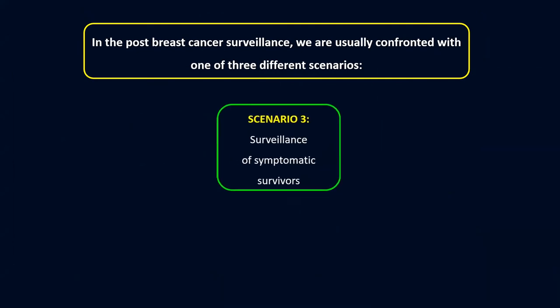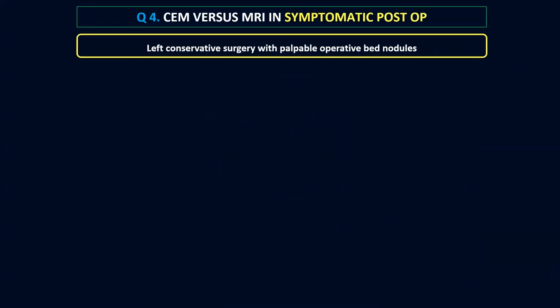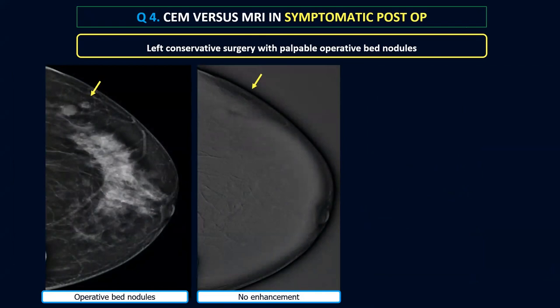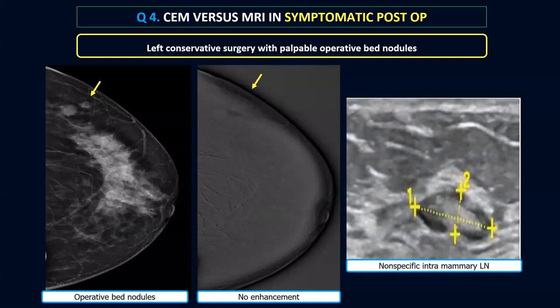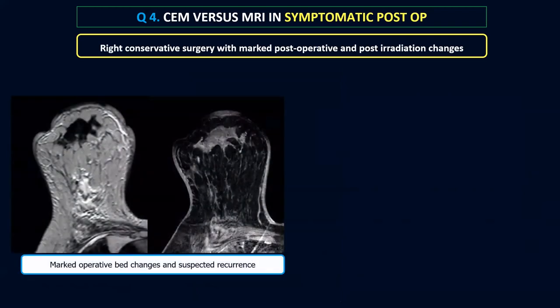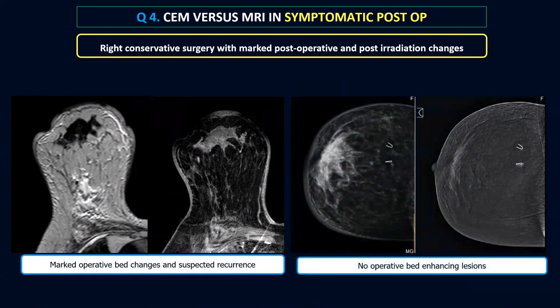For scenario three — symptomatic survivor surveillance — this should be taken seriously and we should proceed to more advanced imaging. One patient with left conservative surgery and palpable operative bed nodules had contrast mammography showing no contrast uptake — these were simply non-specific intramammary lymph nodes. Another case with right conservative surgery and exaggerated post-operative inflammatory changes: MRI suggested operative bed recurrence with pre-pectoral edema and diffuse skin thickening. However, looking at the contrast mammogram, there were no operative bed enhancing lesions — biopsy revealed simple inflammatory changes at the operative bed, where contrast mammography was the more accurate modality.